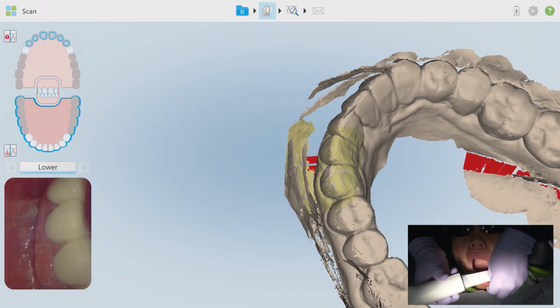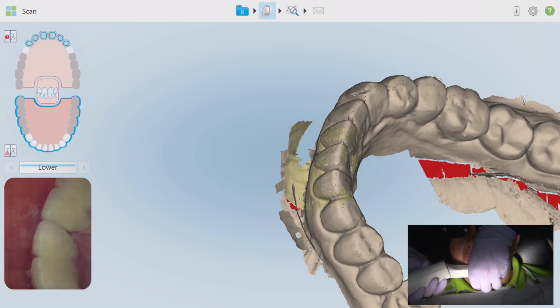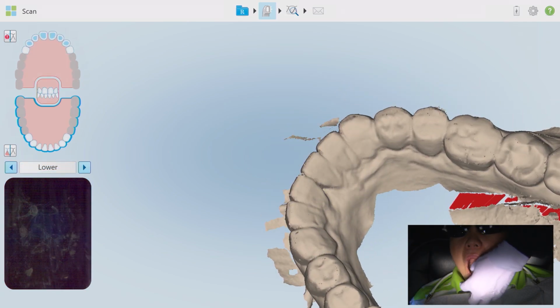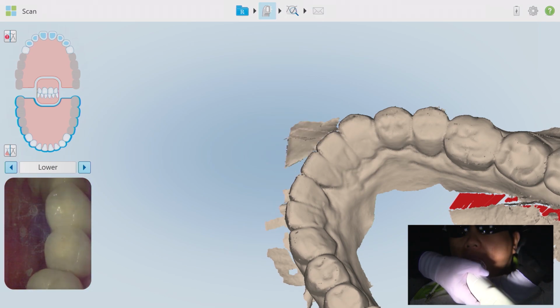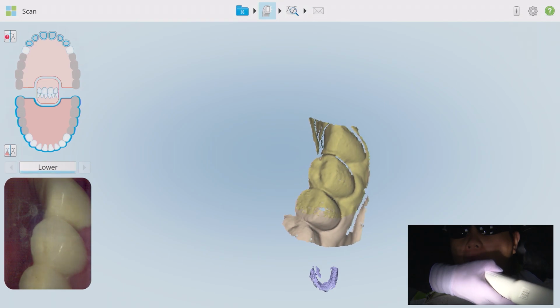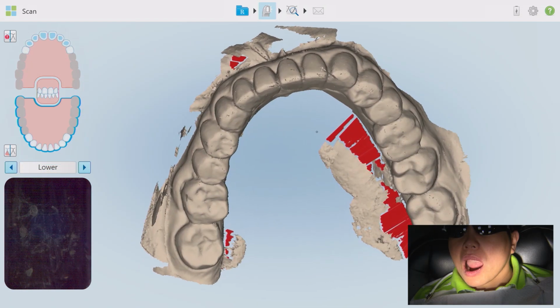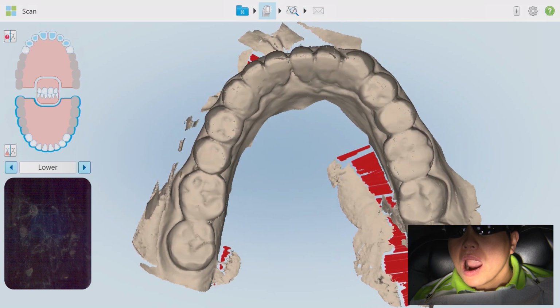Start with the wand on the incisal edge of either cuspid area and rock from incisal to lingual and then to the buccal. Stop this scan and move to the contralateral side where the motion is replicated. Each of these incisal edge detail scans should take no more than 5 seconds each to acquire. The final information to scan is the bite registration.